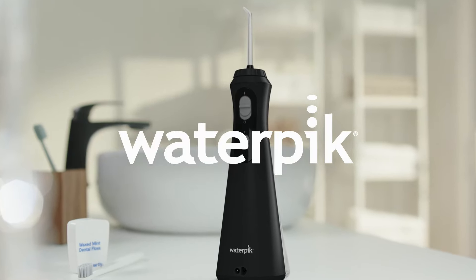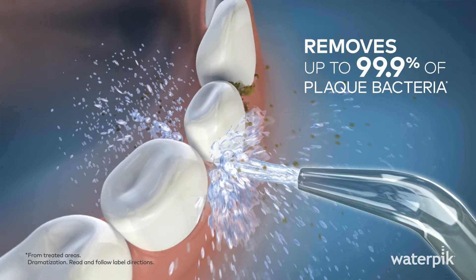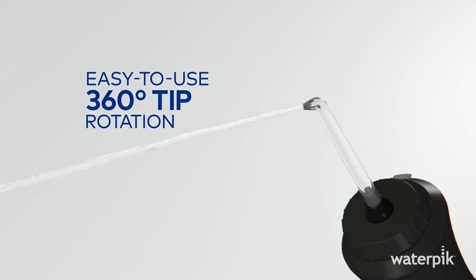Adding a Waterpik water flosser to your daily oral care routine can be exciting. Pulsating warm water cleans deep, removing up to 99.9% of plaque bacteria. The special 360-degree rotating tip easily reaches your whole mouth, even back teeth.